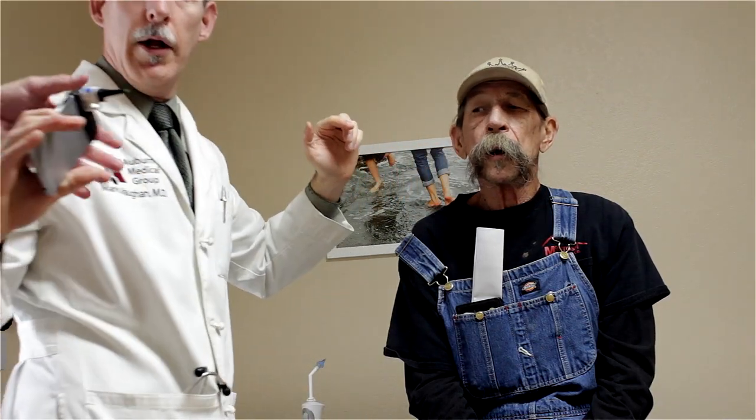There's a spot of blood — that may have been from me earlier though, not from the irrigation. Still not seeing an eardrum; we're still goopy. Still making progress. Oh hell, that chunk — we're getting there.